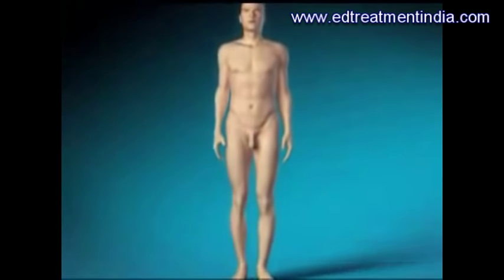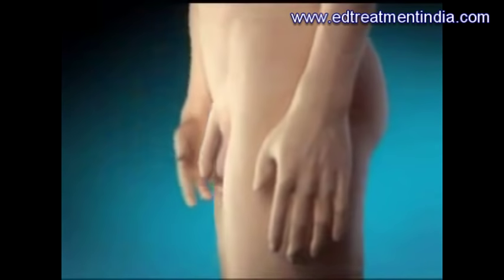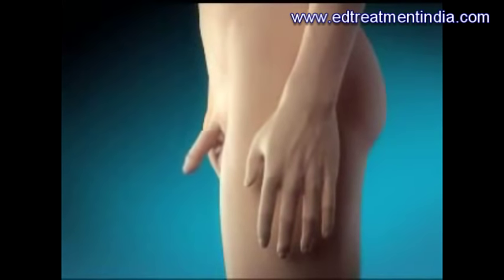With the prosthesis deflated, the penis looks natural. To inflate the prosthesis, the man squeezes the pump several times, transferring fluid from the reservoir into the cylinders.